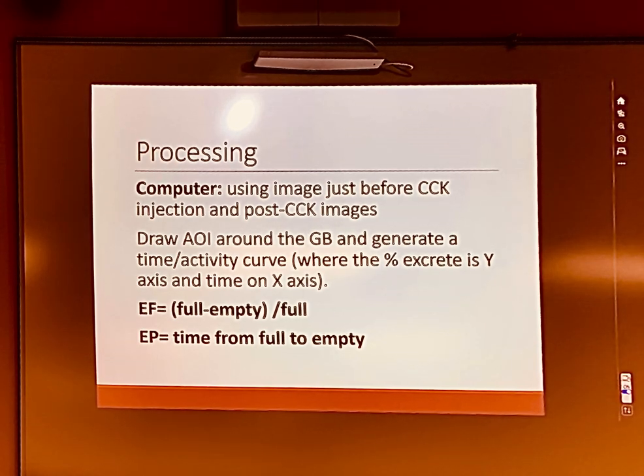Because you're only moving 2 pixels, but if your patient sneezes or coughs, you're looking like this much of a drop. You can't fix that, unless you can do it frame by frame. Now, some of the old equipment, you could do whatever you wanted. I could put one region up here, I could put one down here, I could put one up here. It did not give a crap, it would calculate it. Now, in an effort to make everything fail-safe, they've made our lives longer.